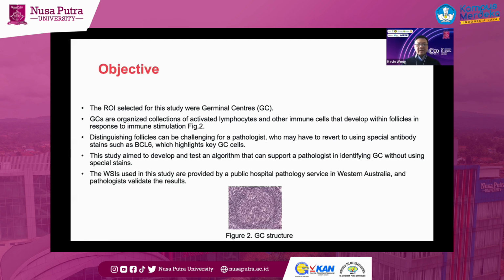So a lot of times, pathologists, by identifying the GC and then trying to understand the features under the GC, can more or less diagnose whether something is cancer or non-cancer. Right? We'll look at later on in the next slide. I'll tell you what kind of cancer that they're looking at.